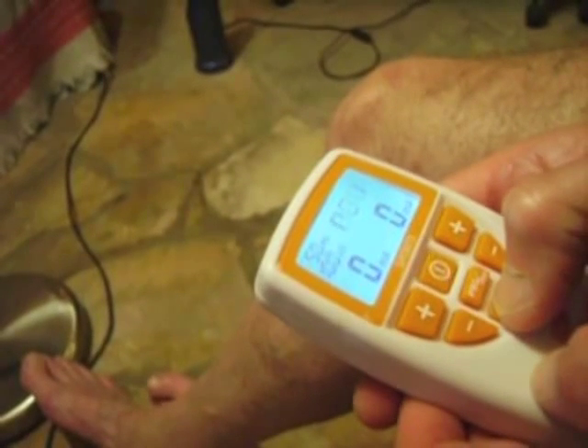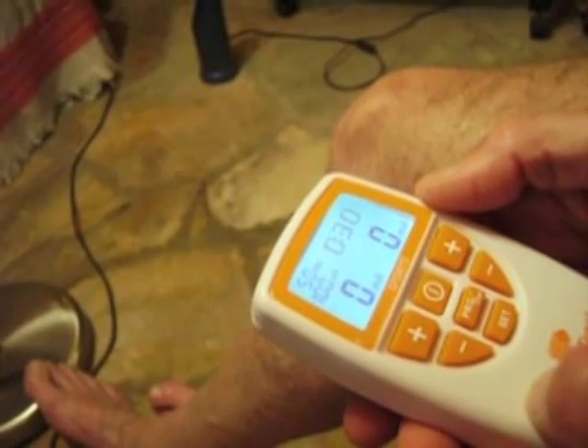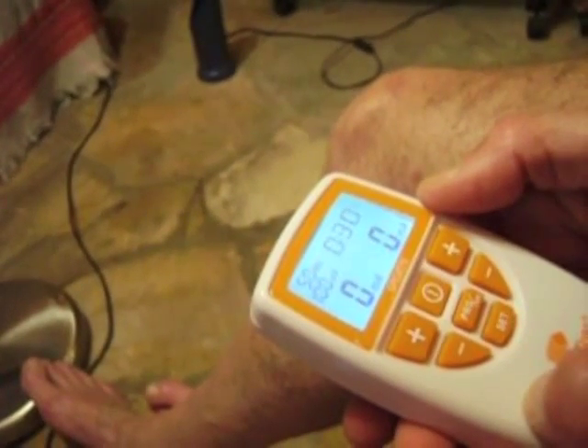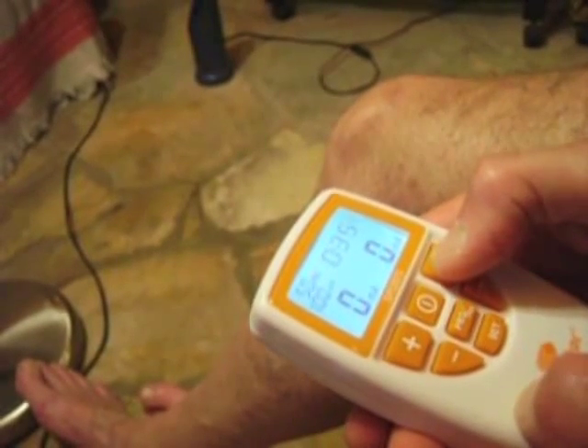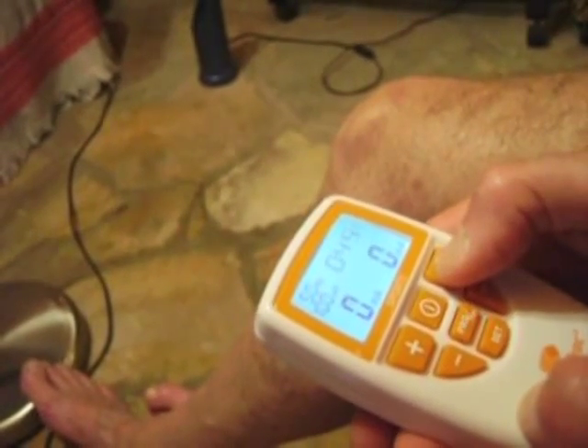The next parameter is the time of each session. I normally set this to the maximum 59 minutes — not because every session has to be that long, but because it allows you to choose when you will stop your session without being limited by the machine.